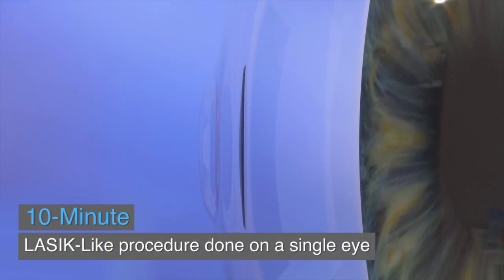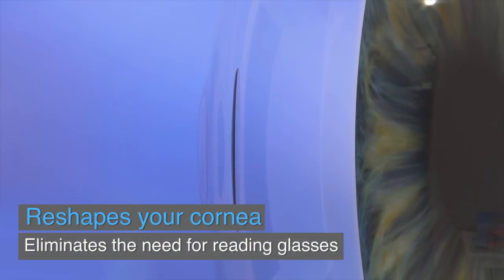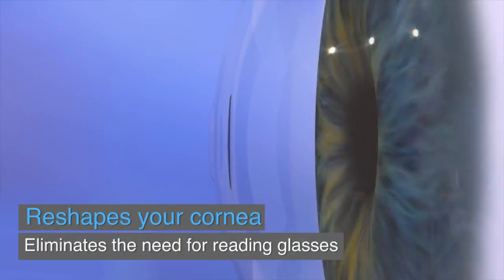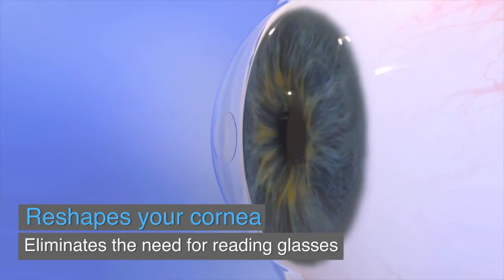Instead, the inlay is gently placed in the first few layers of the eye in a simple 10-minute LASIK-like procedure. Raindrop Near Vision Inlay helps reshape the front of the eye and restores near vision, offering a long-term solution to presbyopia.